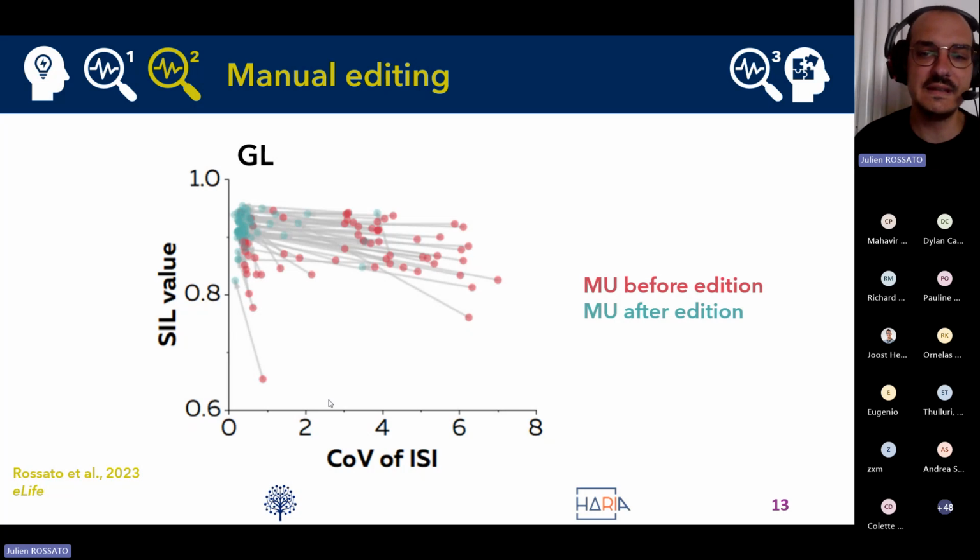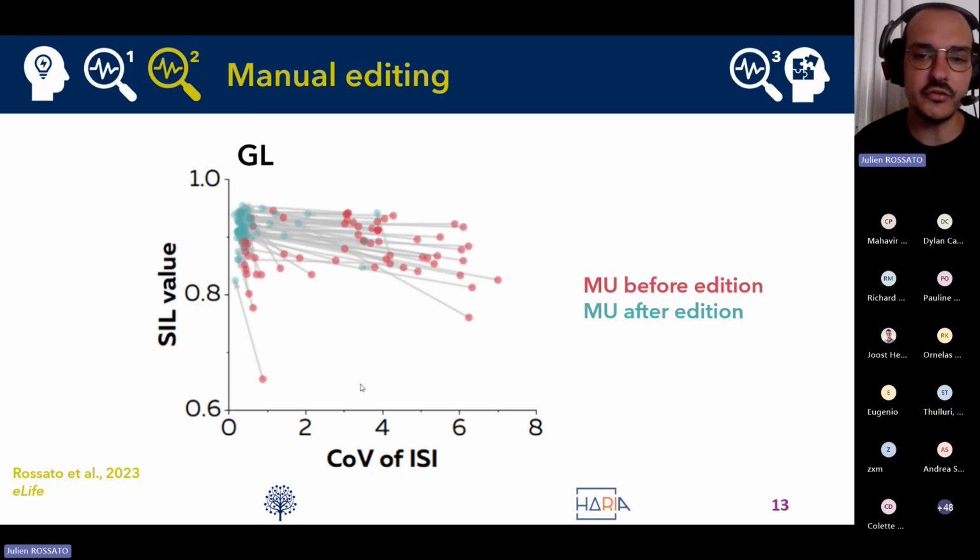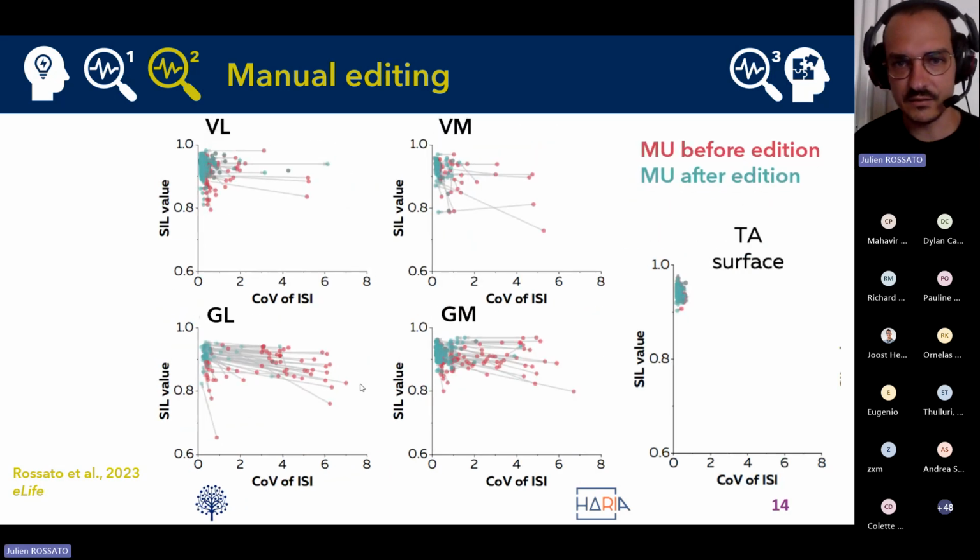The motor unit is therefore better defined, allowing us to obtain a better separation vector to apply during real-time tasks. And if we look at the stability of the discharge frequency, the variability of instantaneous discharge rate, you can see that it is also greatly improved by the correction of false positives and false negatives, allowing us to obtain a better classifier to apply during real-time tasks.